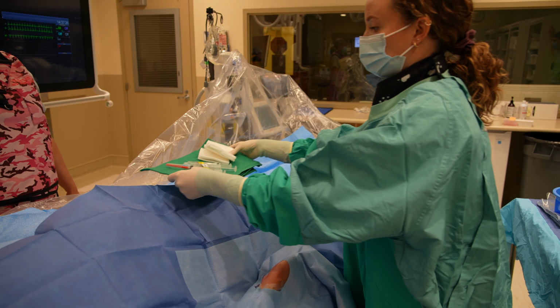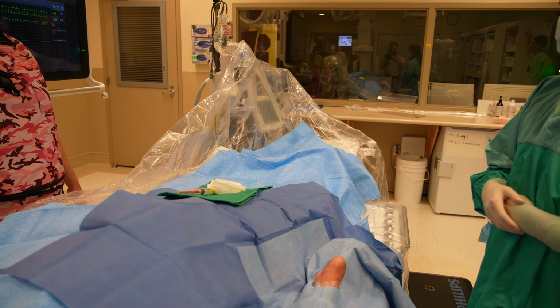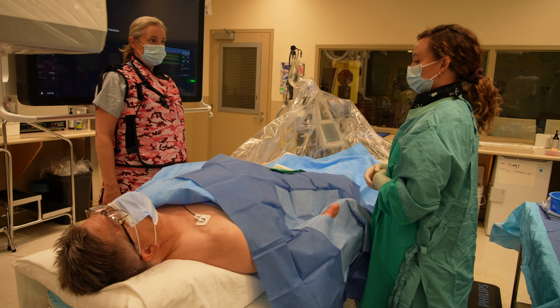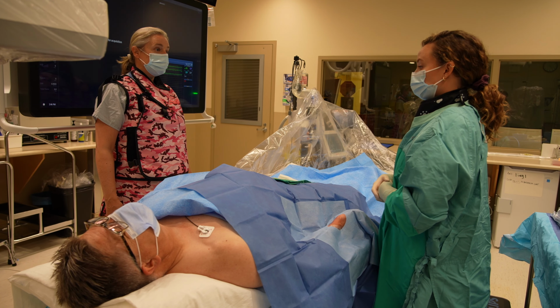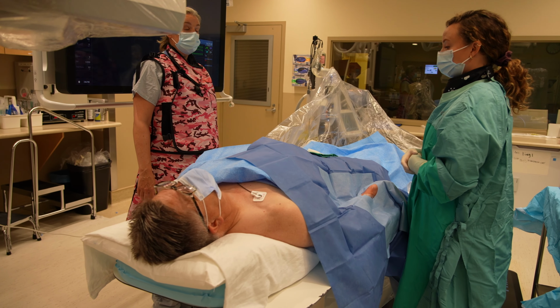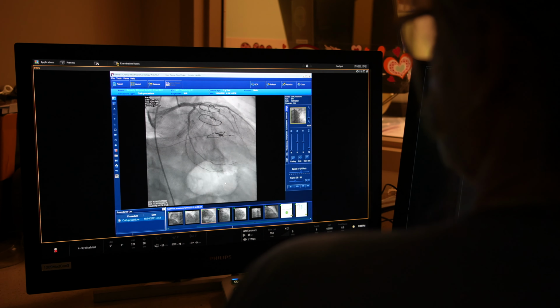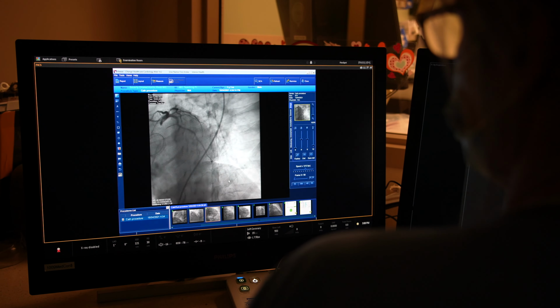During the procedure, it is important that you lie flat and still and to breathe as normally as possible. The cath lab staff will place lightweight equipment on your legs and chest. Moving around excessively can disrupt this equipment. It can also make the procedure more difficult for the cardiologist, as movement can affect the placement of catheters within the heart. You may feel the catheters as they move up to the heart, but this should not be painful.